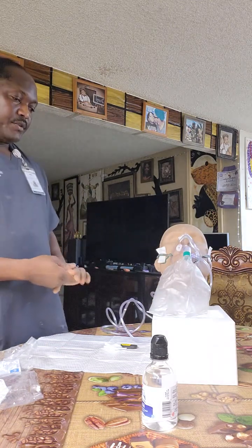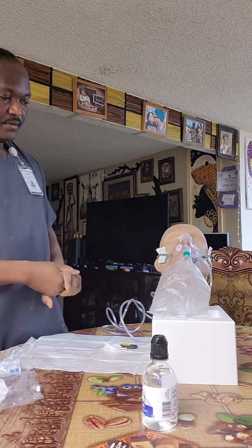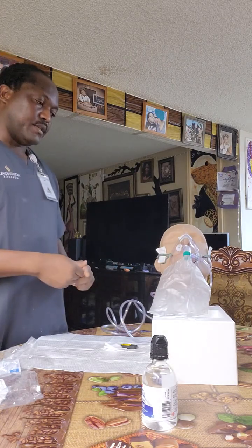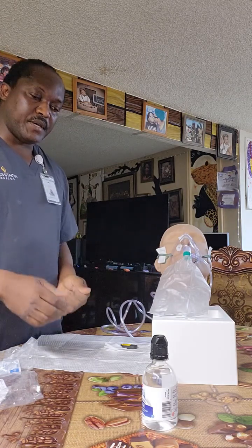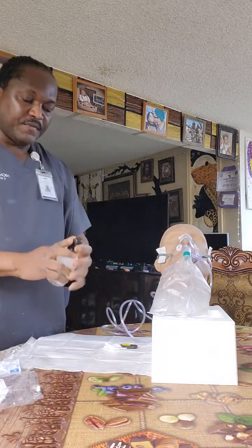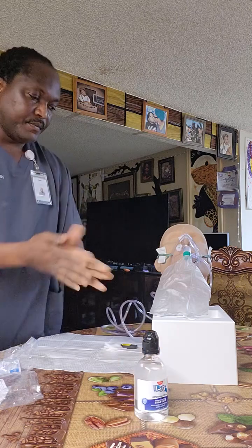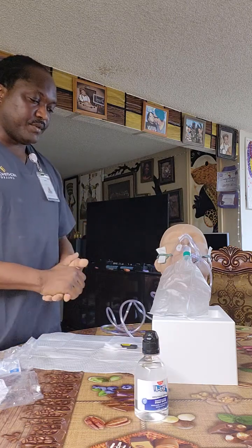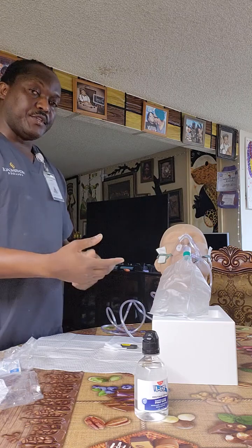So now the patient is doing good, oxygen flowing all right. Now the doctor wants us to take the oxygen out. So I'll come back in, perform hand hygiene, and I'll let the patient know that the doctor wants us to remove it. So now I'm going to take it off.